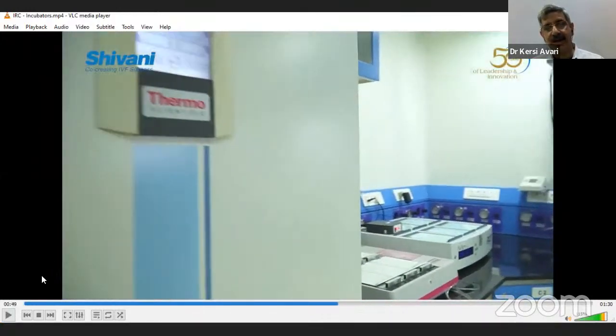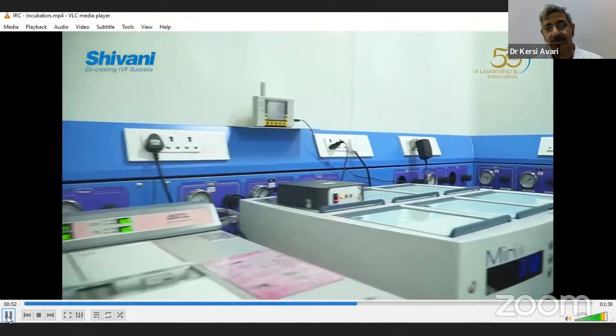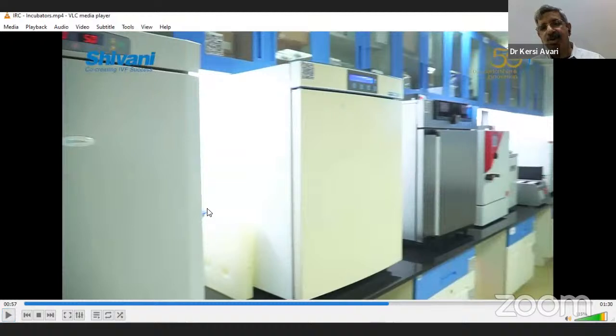This is your box, which I had already explained to you. I think this is just a second round. These are also other examples of box incubators of different companies. Now, see, in some cases, the display panels are on the head part and the door is just flexible. You can fix it from the right side, you can fix it from the left side. So there is no tension of any electronic damage taking place in the door assembly.